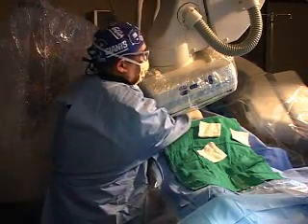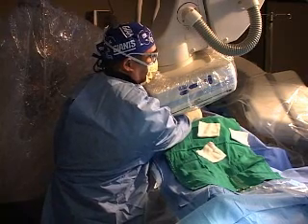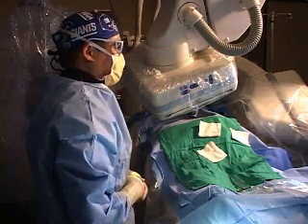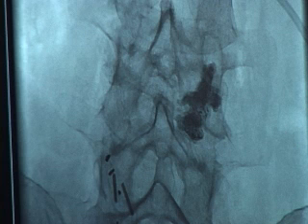When I break off the cement from the needle, what I'll do is fully retract it. Go side to side, top to bottom. The reason I do this is I want to make sure that the cement stays confined to the pedicle and the vertebral body and doesn't go towards the skin.